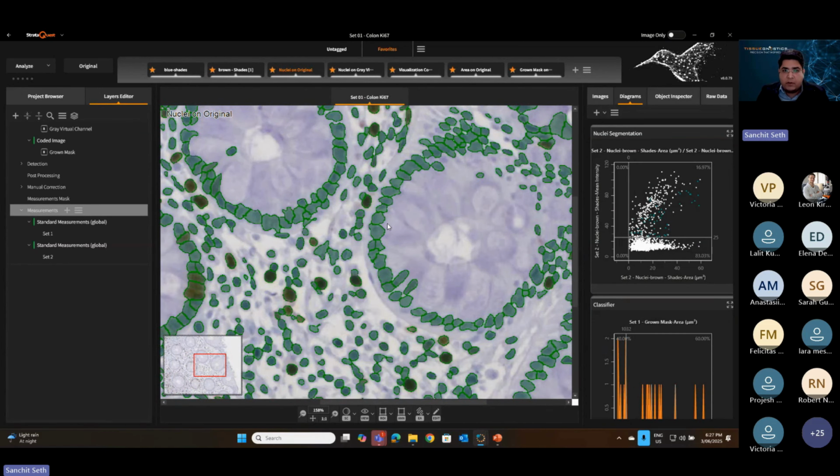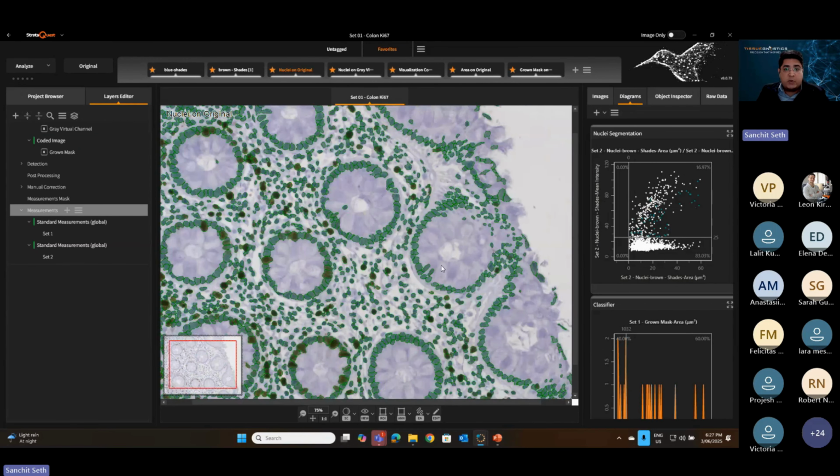It does not just give you the Excel sheets or just the data points, but you can actually see what your data is telling you. Because we click on the cell and it is blinking in the dot plot, we are going from image to data. We call it the forward connection. And the other way around is also possible.